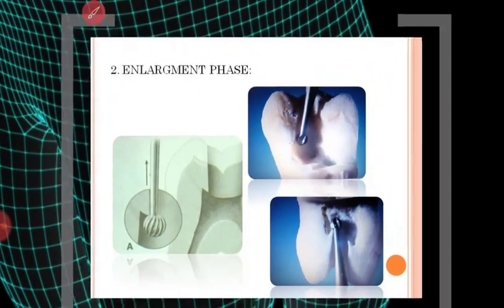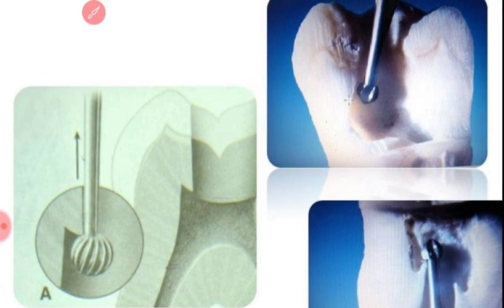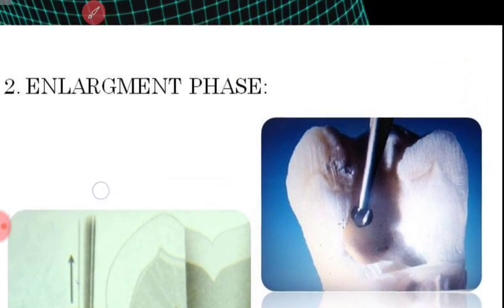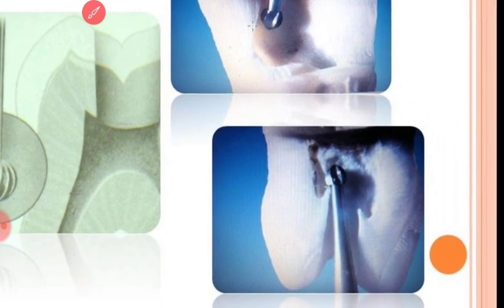Okay, and once you are inside the chamber, use a carbide round burr, not a diamond round burr. Use a carbide round burr and cut it on the outstroke like this. You can see the angle. This is very important. So you are just de-roofing the chamber. You are removing everything. You are de-roofing the chamber.